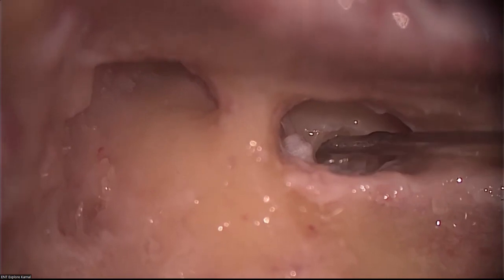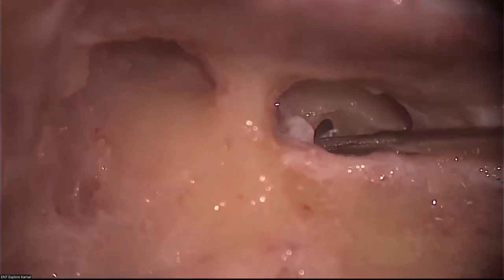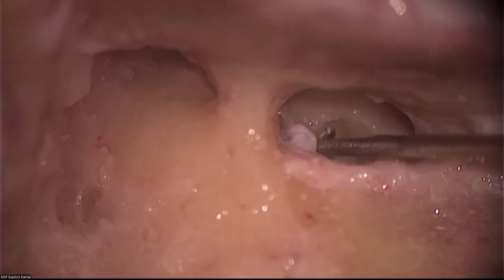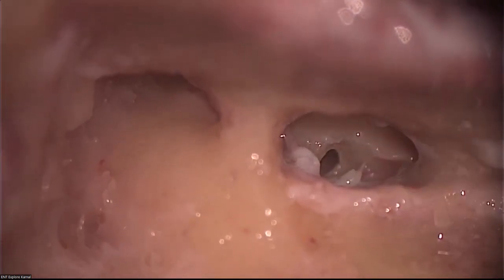Medially, we are not supposed to run in the medial wall like this. Medially are the openings of the cochlear aqueduct and the inferior cochlear vein in the medial wall. See, I am going in the medial wall. Can you see there? The safest region, which you can easily widen and make straight, is inferior.